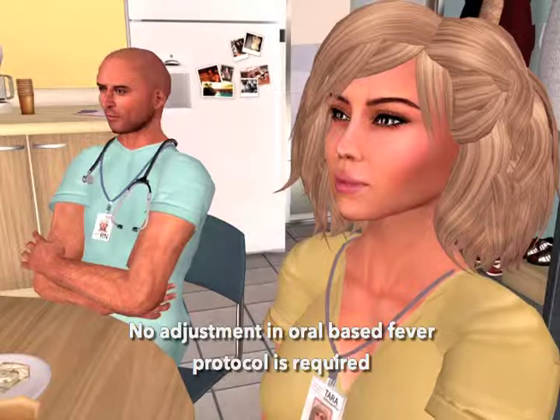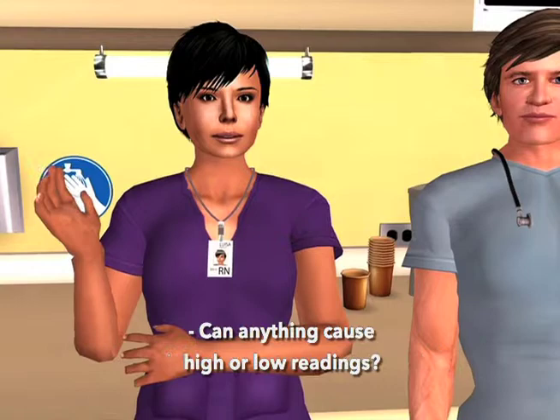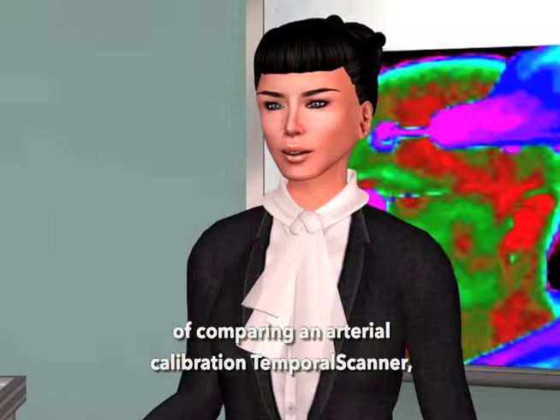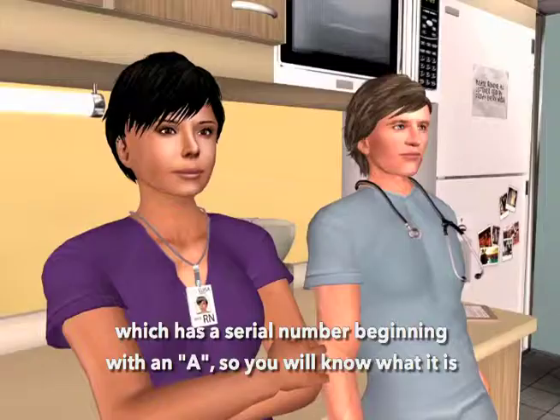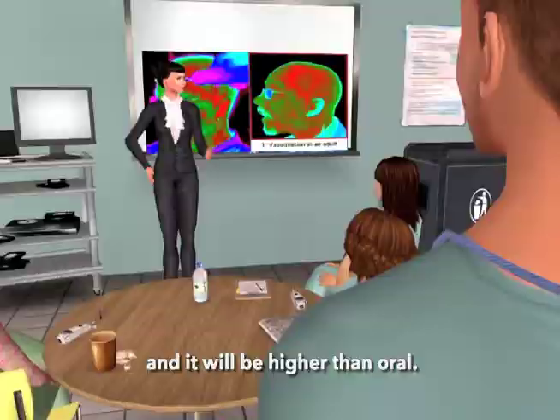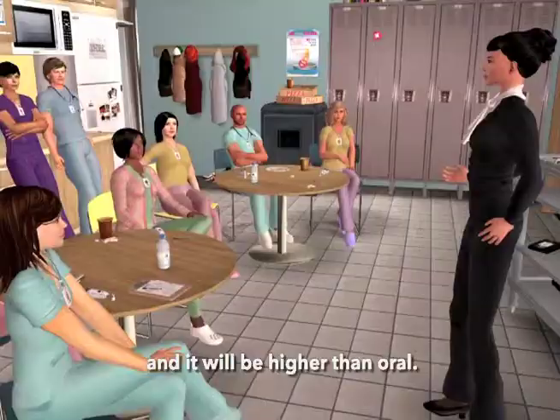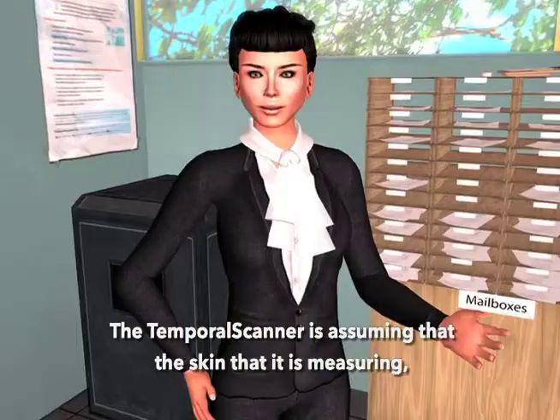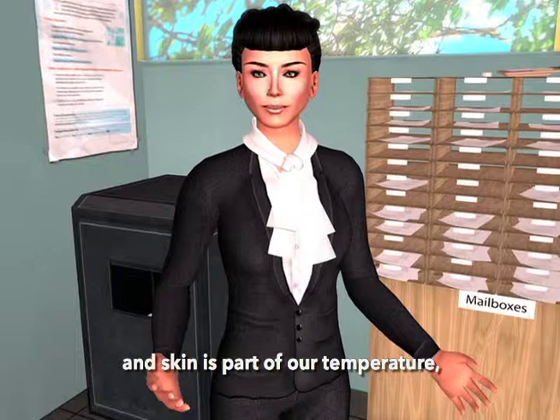Can anything cause high or low readings? High readings are typically the result of comparing an arterial calibration temporal scanner — which has a serial number beginning with an A — to an oral thermometer. Arterial temperature is a core temperature, and it will be higher than oral. Another reason for high temperatures is if the area being measured is not exposed. The temporal scanner is assuming that the skin it's measuring has equilibrated to the room, so if it's covered, it's going to give you an artificially high reading.